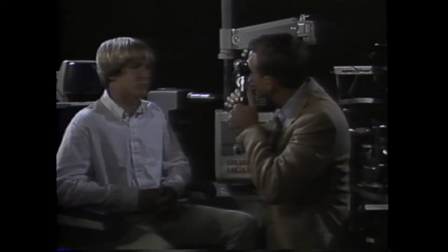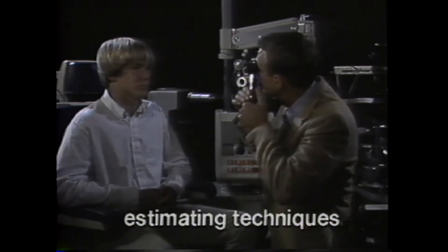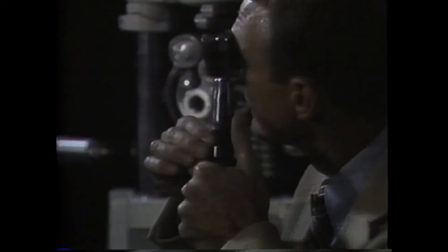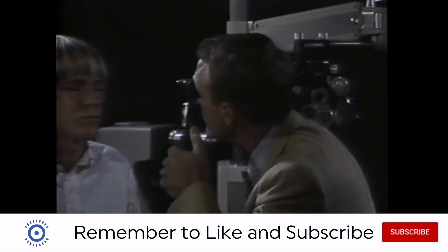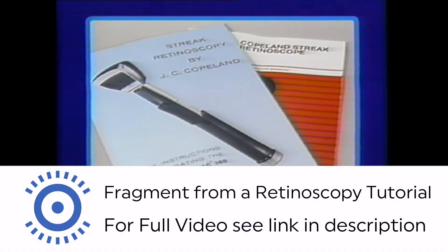If retinoscopists had all the expertise and experience of Jack Copeland, they could use estimating techniques without lenses to come very close to the best correction. Copeland used neutralization by moving back and forth, enhancement of the reflex by spiraling, and filament focusing by dropping the sleeve and moving close — all methods to estimate in the various ranges of refractive correction. Instruction manuals for his retinoscopes provide further explanation of these estimating methods.